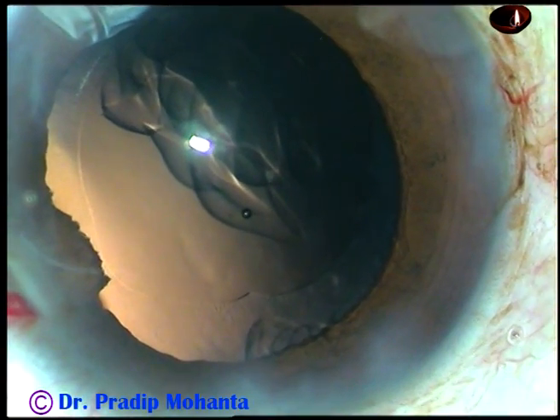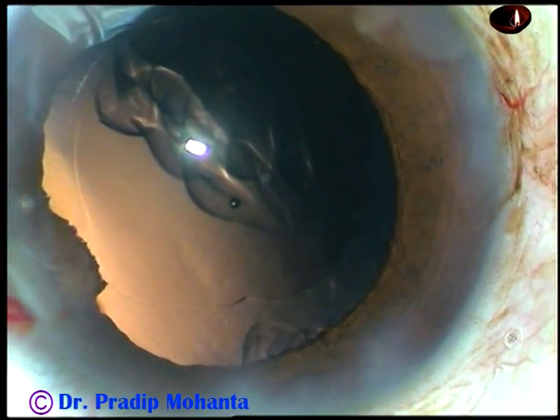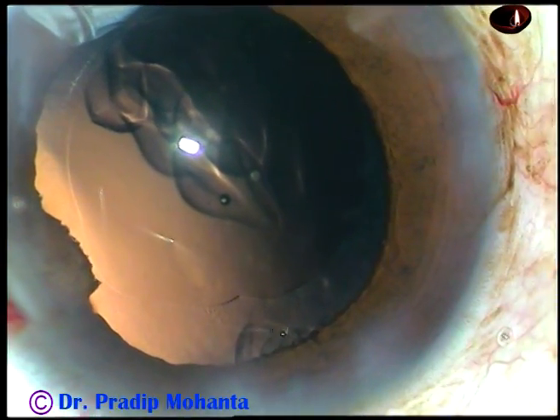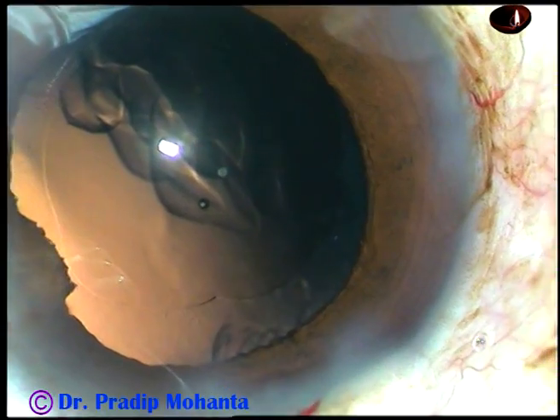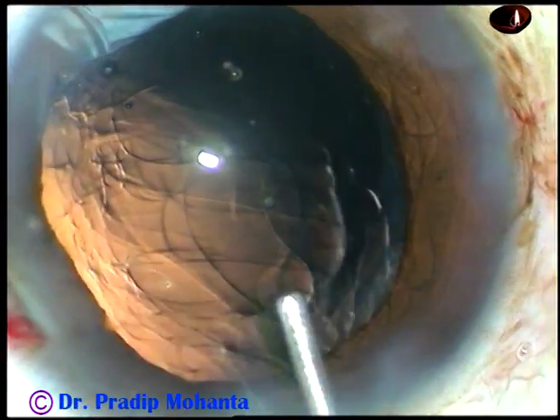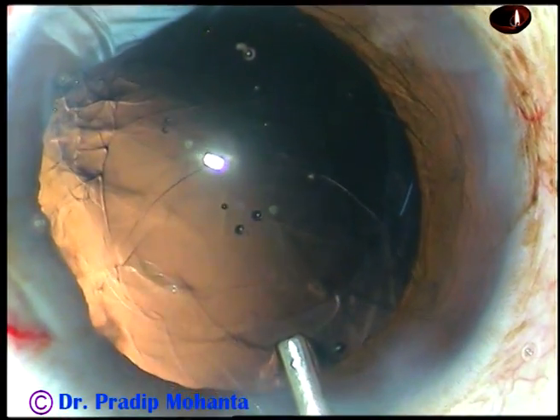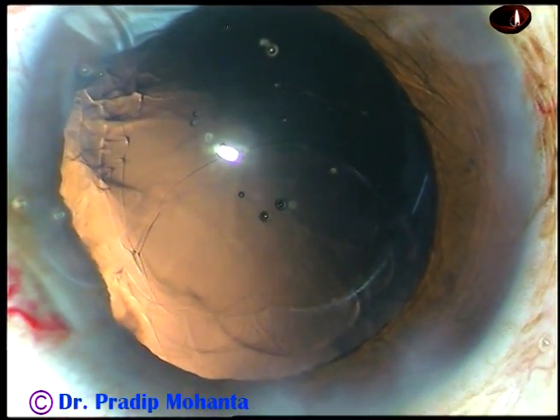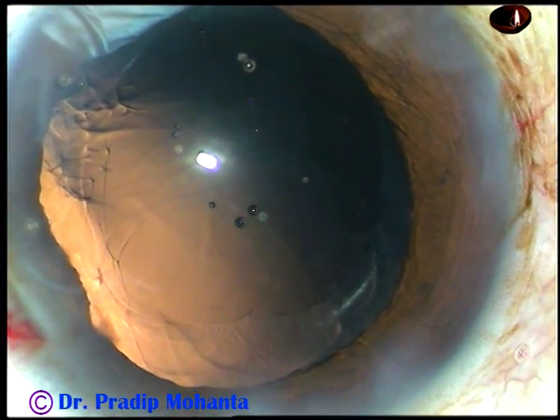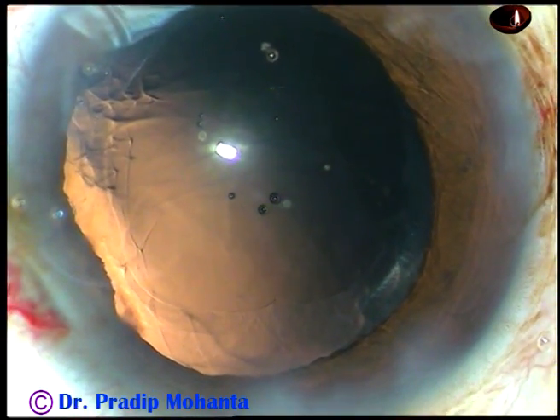Let us observe these in slow motion. Cortical clean-off has been done. And now a viscoelastic substance — 2% hydroxypropylmethylcellulose or any other viscoelastic substance — is injected into the anterior chamber, and the capsular bag is inflated with this viscoelastic substance.